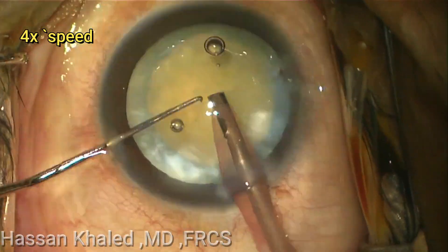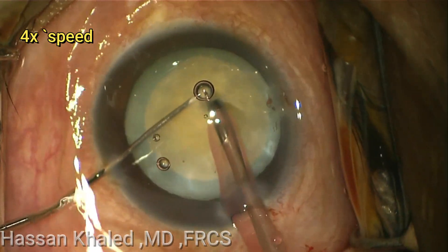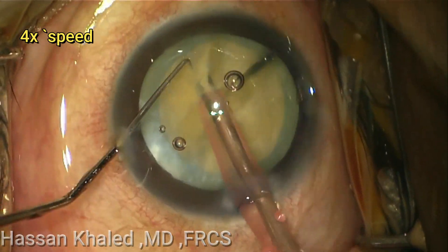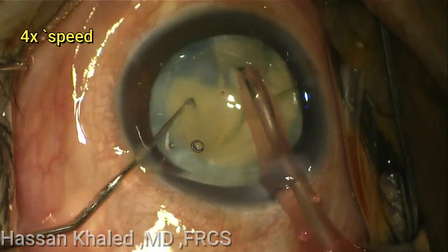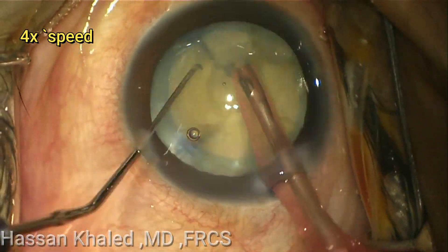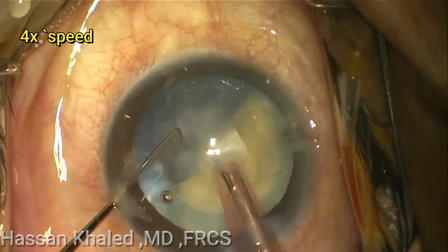Then, using the vertical chop technique for this dense cataract, the nucleus has been chopped inside the capsule into smaller pieces. Then emulsifying each piece alone, as it's clear.